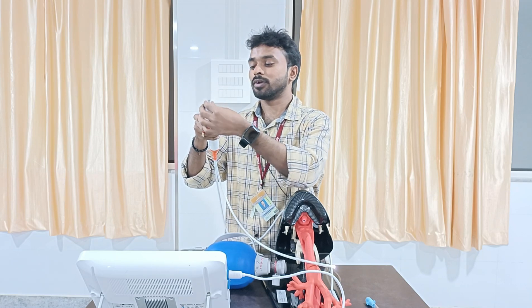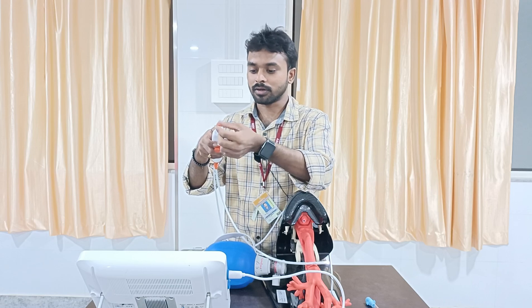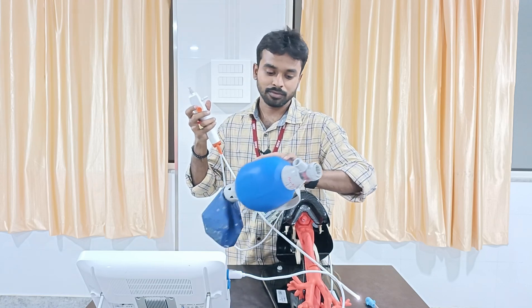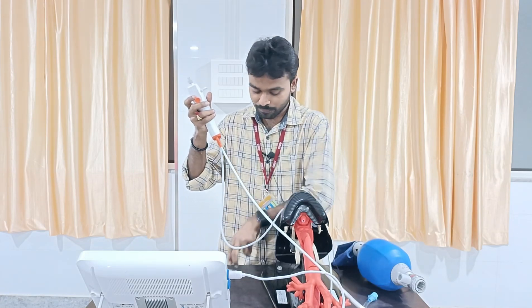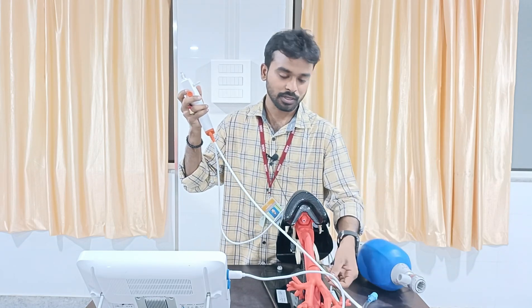Then there is one more port where we can connect oxygen and instill some fluids and water, so that we can clear the airway. For confirmation, I also have with me an Ambu bag, one endotracheal tube for placement of the tube into the trachea, and a 10 ml syringe for inflation of the cuff.